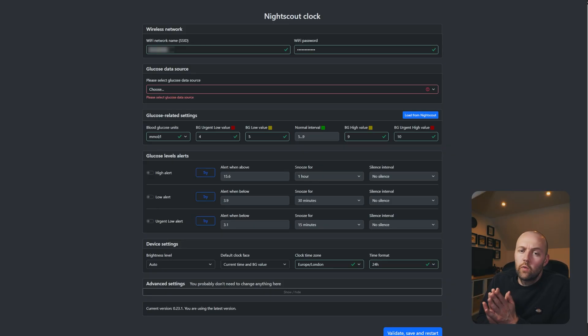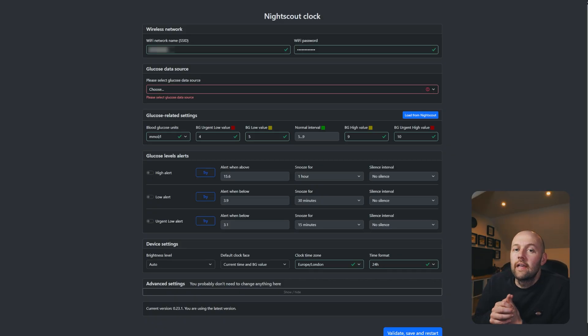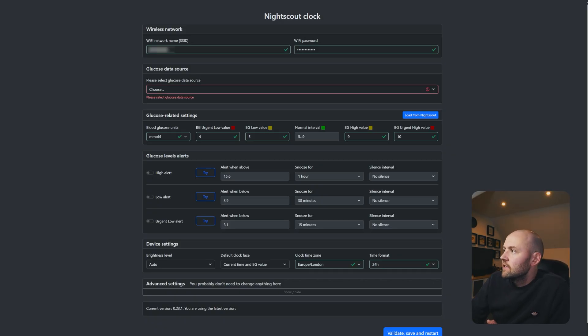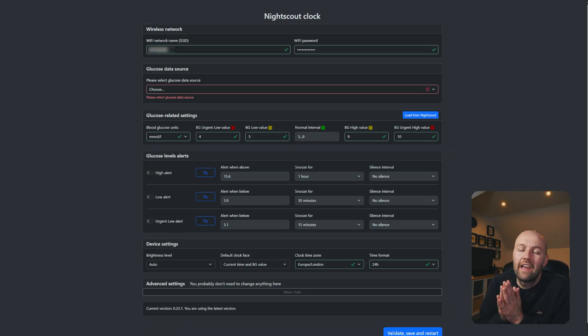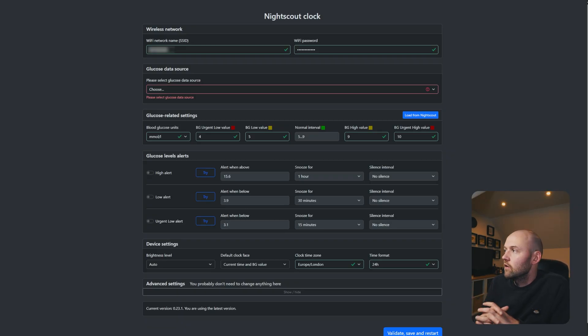Right, let's jump in. So we're going to navigate to the page where we actually set up the clock itself. You can see at the top here I've got the wifi name already filled in and the password. The next part is going to be the glucose data source. This is where we're going to connect Nightscout itself to the clock.